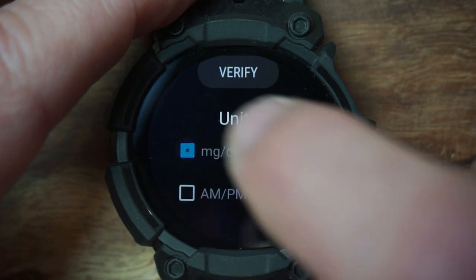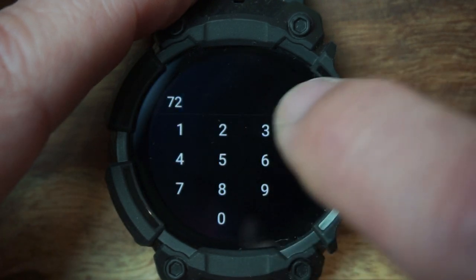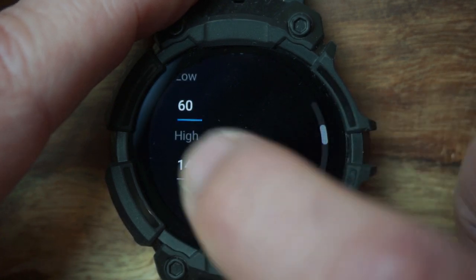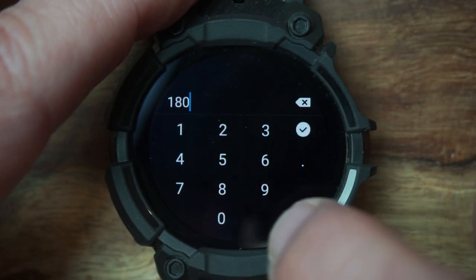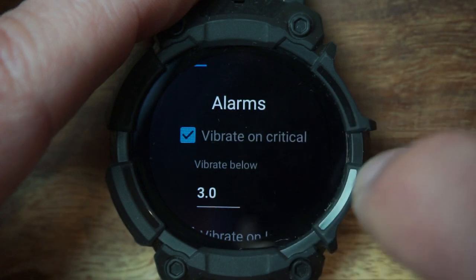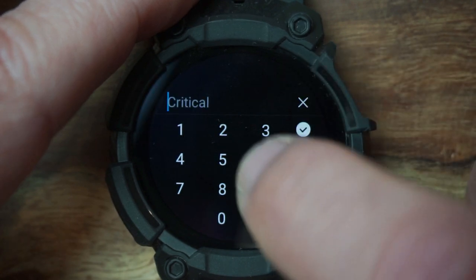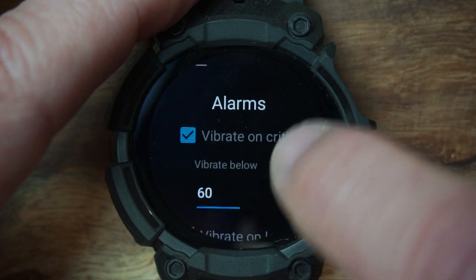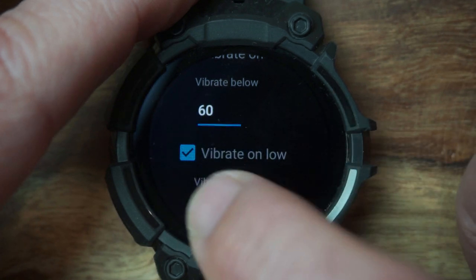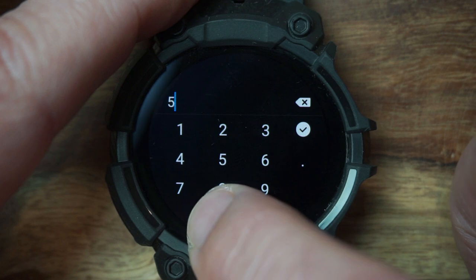Set your units — I'm in the US so I use milligrams per deciliter. Enable the AM/PM clock if you want to see the time. Then set your low and high ranges. I don't want a low alert unless I'm going below 60, and I don't want a high alert unless I'm going above 180, because that's what happens after eating if I don't pre-bolus. For alarms, I'll turn that on and switch it to milligrams per deciliter — I want it to vibrate below 60, and set the critical low at 50.